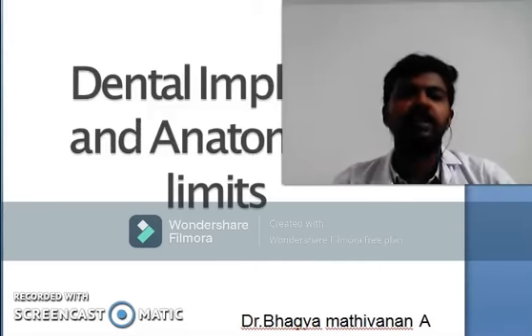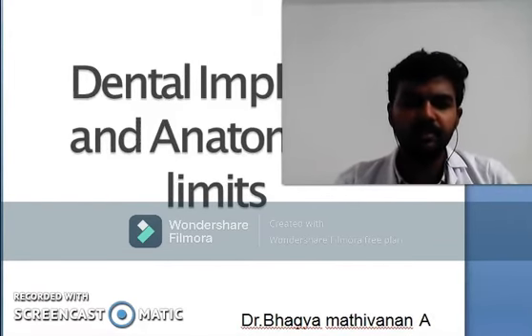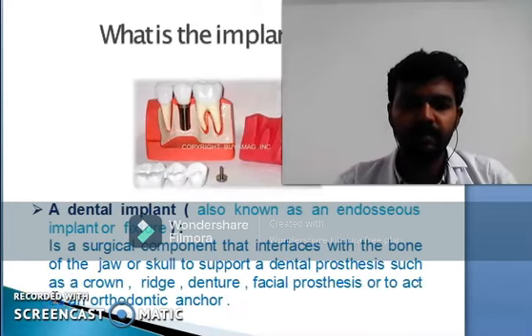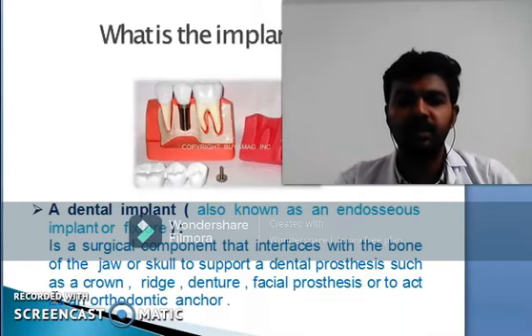Good morning guys. Now I am going to present a lecture on dental implants and its anatomical landmarks. What is an implant? A dental implant is a surgical component that interfaces with the bone of the jaw or skull to support dental prostheses such as a crown, bridge, denture, facial prosthesis, or to act as an orthodontic anchor.